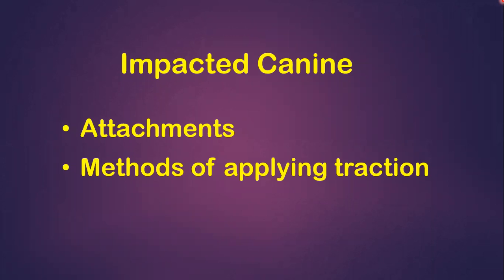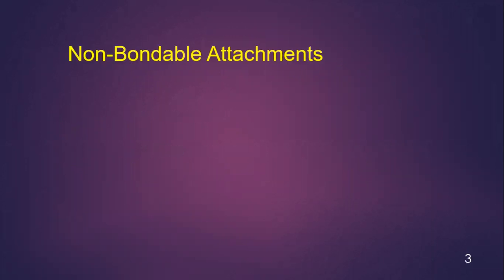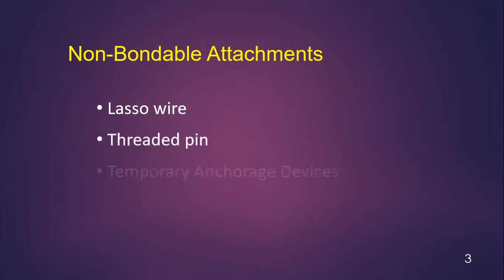In this video, we will explain attachments and methods of applying traction for impacted canine. We will not go into the details. So attachments for impacted canine can be bondable and non-bondable. The non-bondable attachments are lasso wires, threaded pins, and temporary anchorage devices.